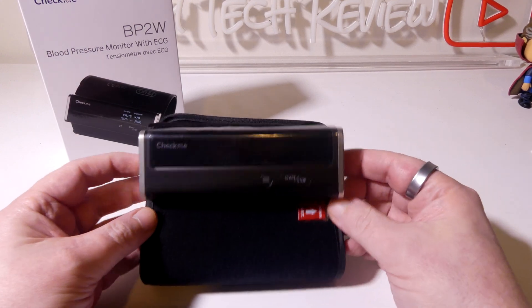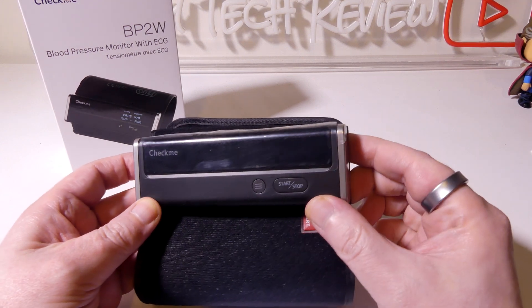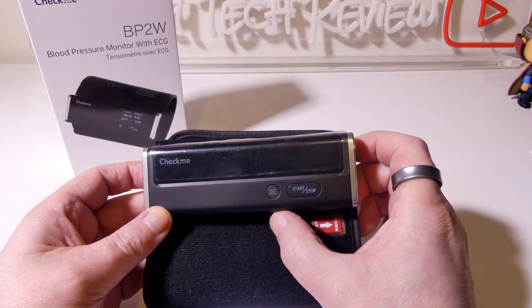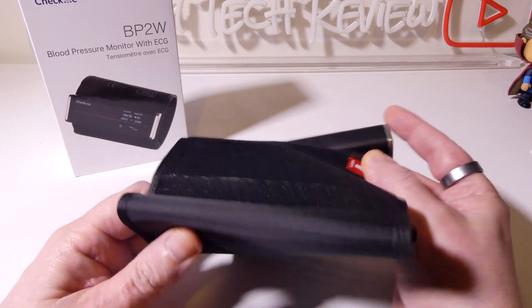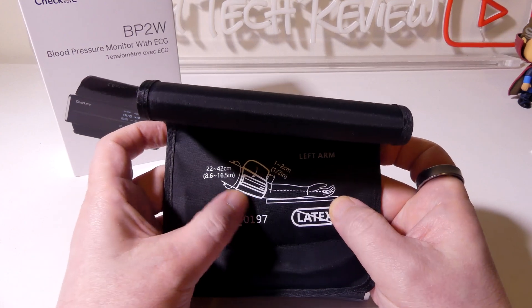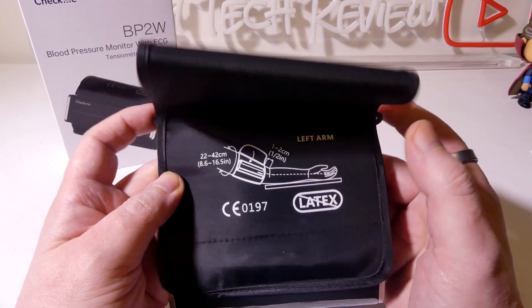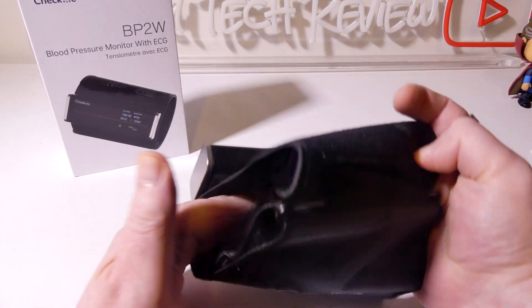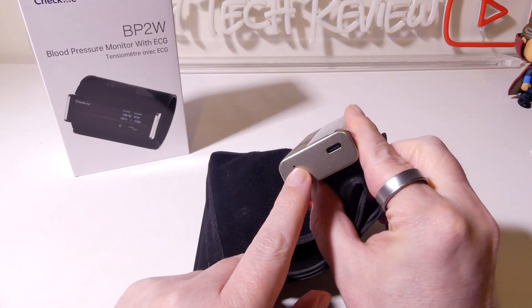Taking a look at the unit itself, you have a few buttons — a start and stop button, a nice LCD screen, and a menu function button on the left-hand side as well. Overall, you can see a nice cuff on here. It shows a diagram of how to make sure it's correctly positioned on your arm. It does not contain latex, so if you are allergic to latex you don't have to worry about that, and it's definitely big enough for larger arms as well.